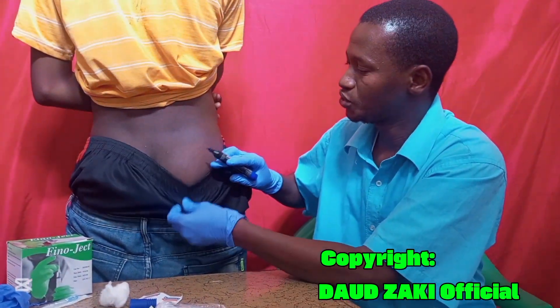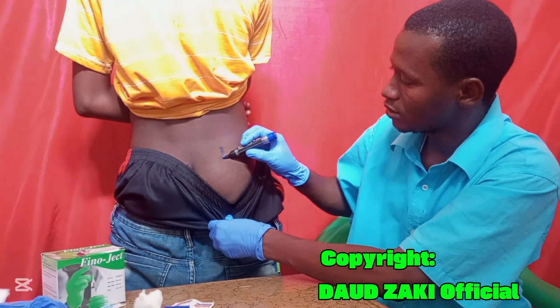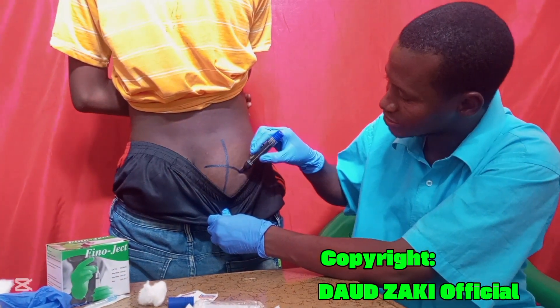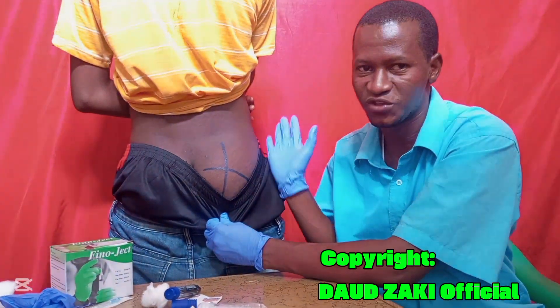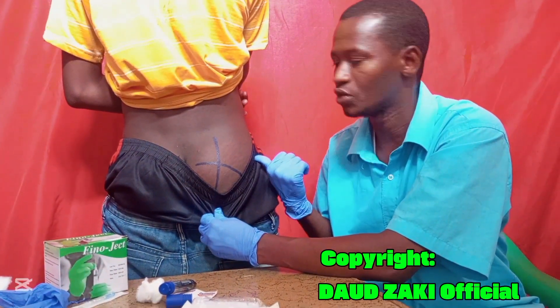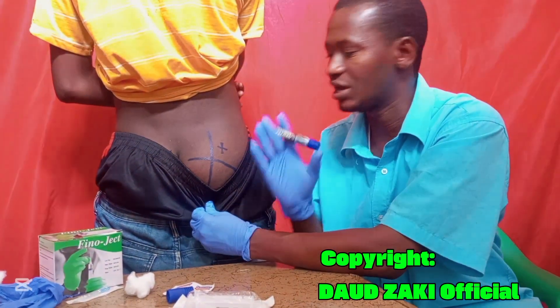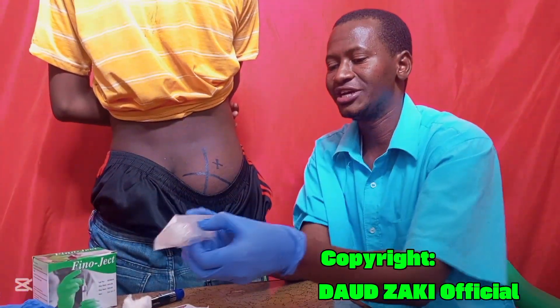This is how you draw the imaginary lines — you create a horizontal and vertical line on the gluteal muscle. When giving the injection on the right side of the patient, you give it in the upper outer quadrant of the right side of the muscle. This upper outer quadrant is where you perform the injection on the right side.